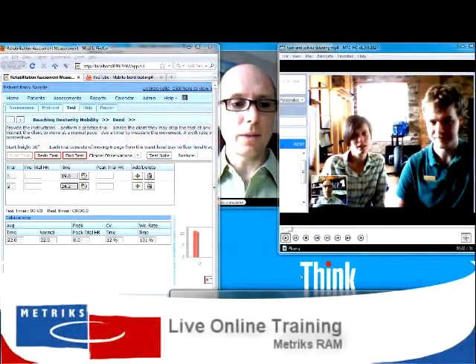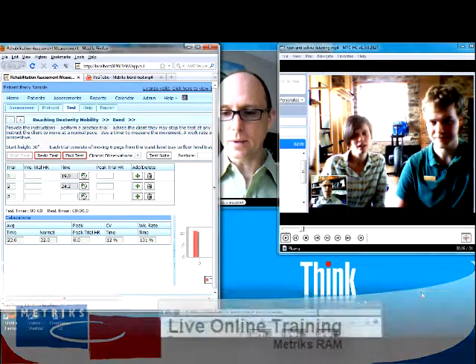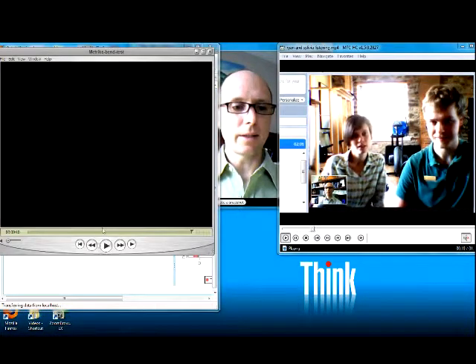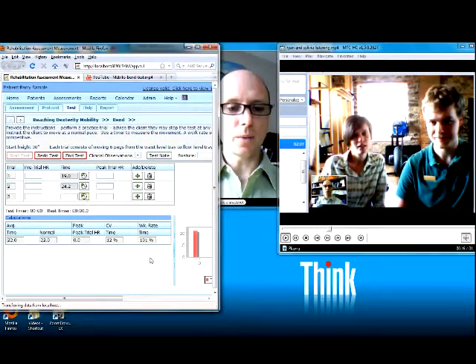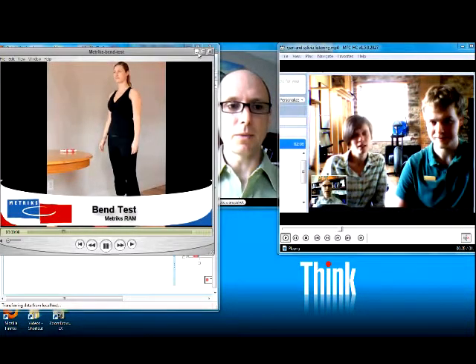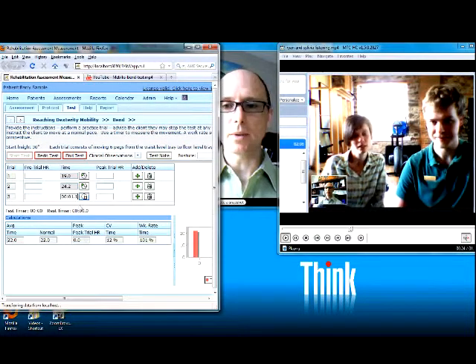We're going to go through and do the test here for the bending. We'll take a look at the bend video as it gets started. As she gets ready to go through, we can start the timer as she starts to make her first move. As she lifts her first pegs, we can start the timer, so the timer is going to pick that off.